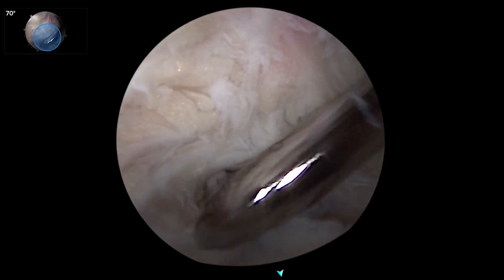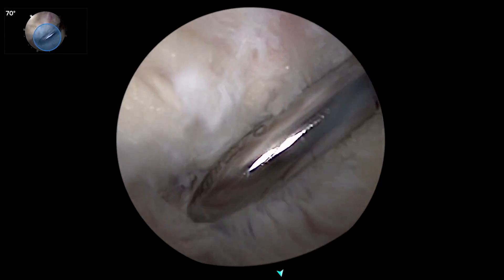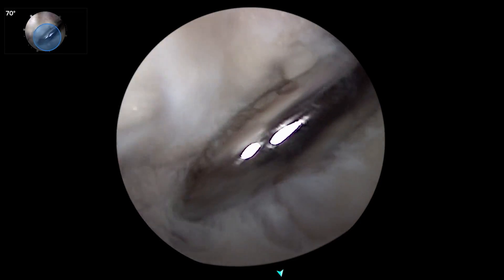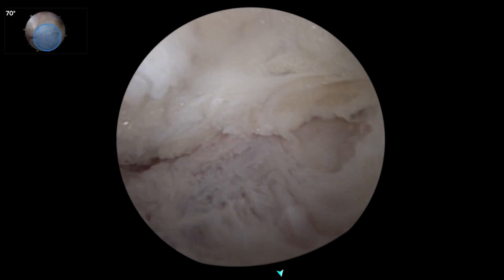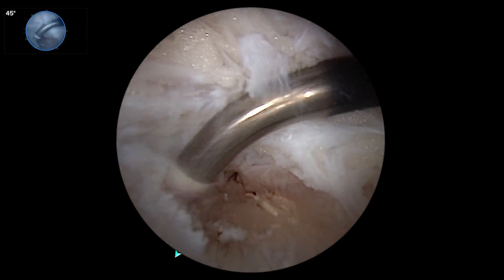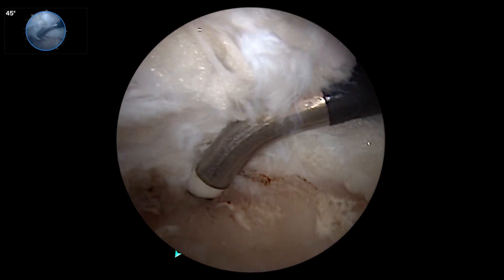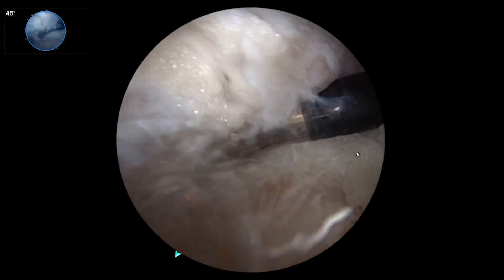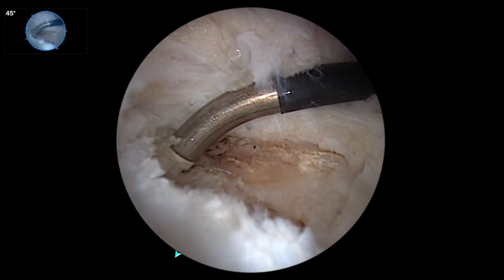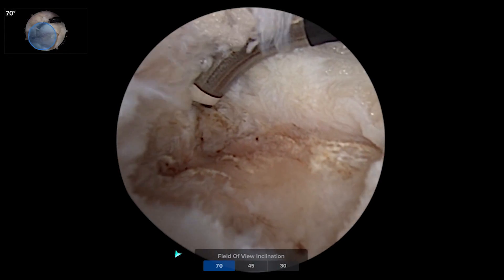Without having to change out scopes or anything else, I go immediately to a 70 and can work all the way down, debriding the rest of the PCL stump. Here's our insertion, here's where we'll want to put our PCL guide. I'm preparing the footprint so that when I bring my flip cutter in, I'm not going to have all this soft tissue around it. You can see I'm all the way down the back of the tibia — this is the most inferior part of the PCL insertion. From the anterolateral portal, I have a perfect view of this both with 45 and 70 degrees.